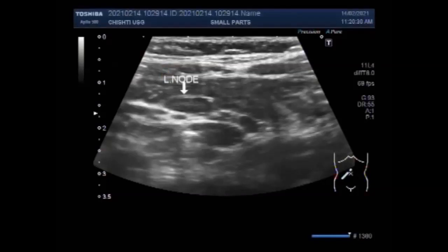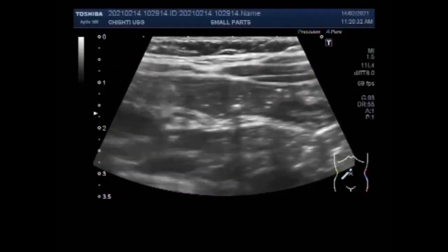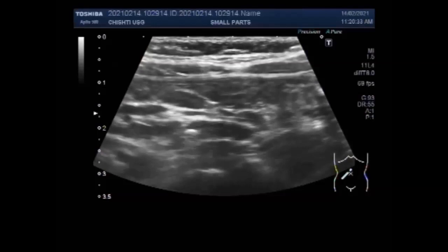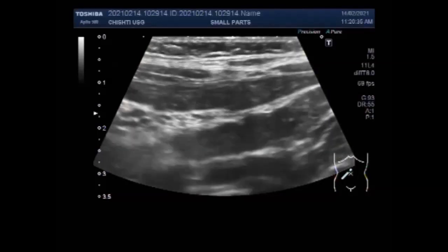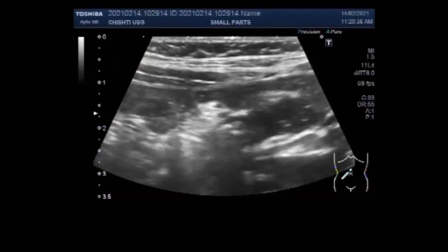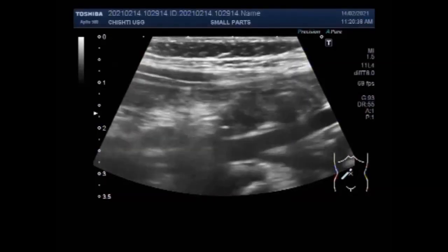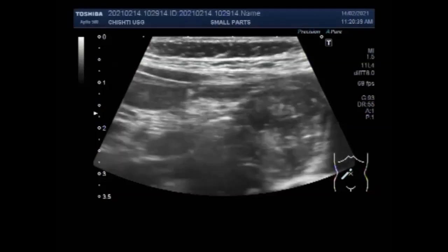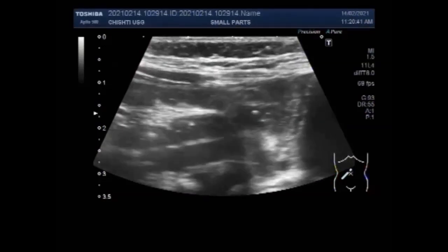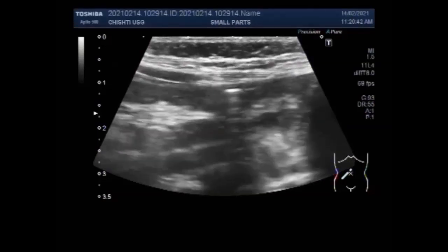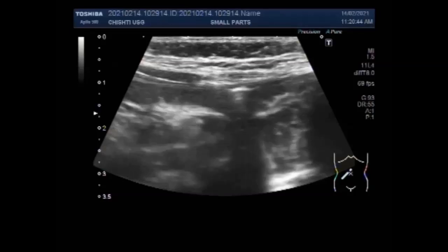Dear viewers, I hope you are all fine. This Suttasone video shows two cases of worm infestation in the gut loops. Both are Ascaris lumbricoides, seen in the gut loops.